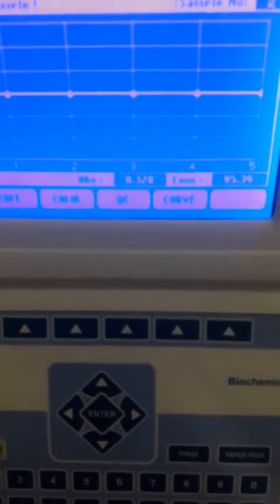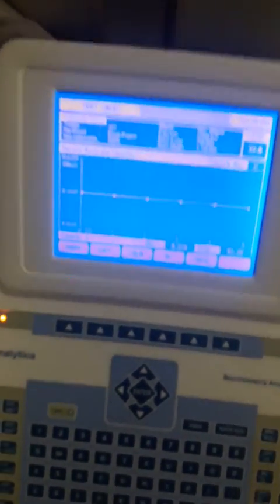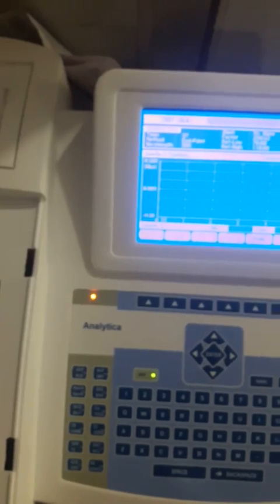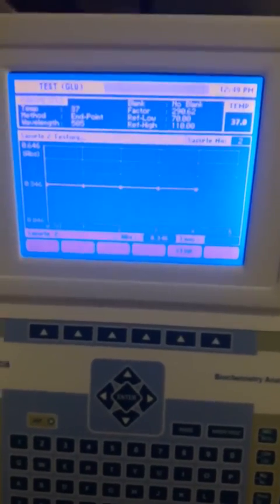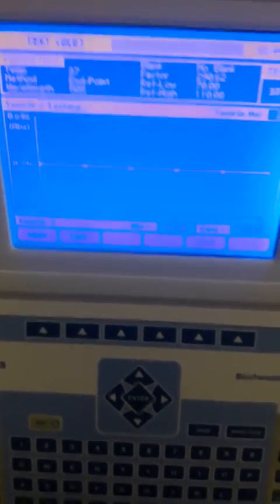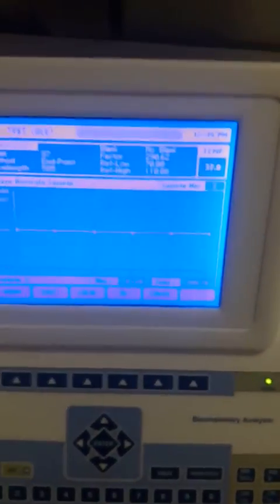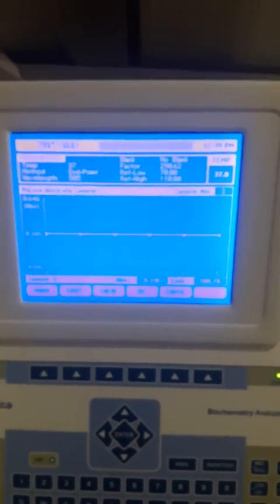It is showing the result: 95. This means the sugar level of this sample is 95, which is within the normal limit. We have another sample we can estimate as well. Once we have opened a window and calculated the factor, we can aspirate samples one after another in sequence and get results continuously. It is now showing the concentration 100, meaning the sugar level of that sample is 100. Since we have two different normal samples, both are giving two different results.